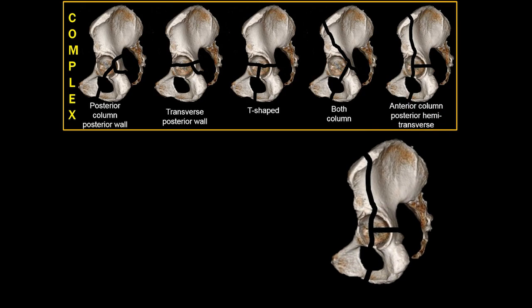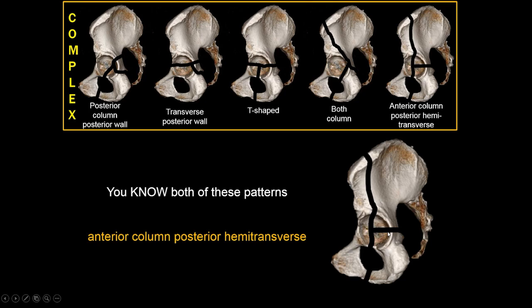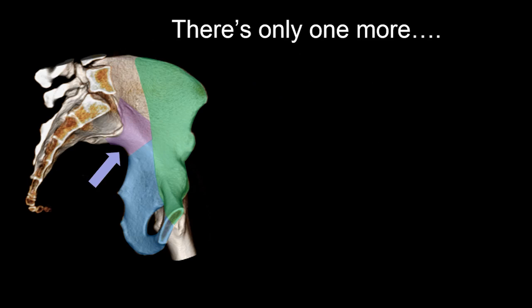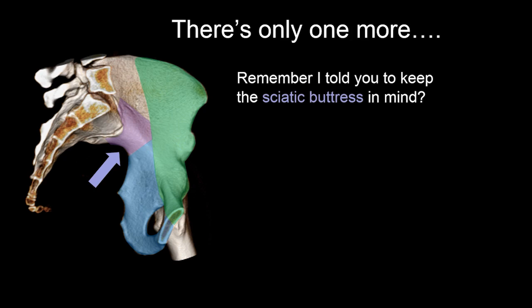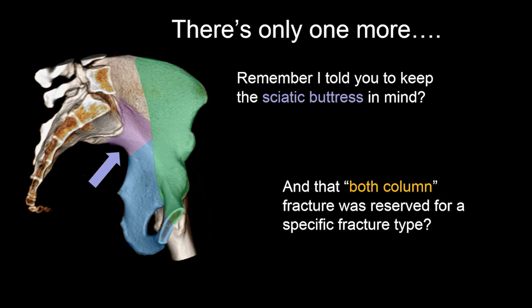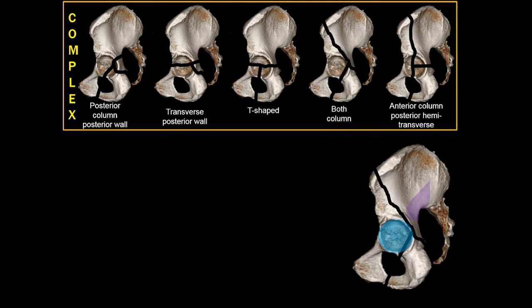The longest-named fracture type is the anterior column posterior hemitransverse. It tends to scare people, but you're already familiar with both patterns: a fracture coming from the iliac wing going down through the acetabulum involving the quadrilateral plate is an anterior column fracture, and you know how to identify the transverse component on coronal images. Put them together and you get an anterior column posterior hemitransverse. And remember to keep the sciatic buttress in mind — the both-column fracture name is reserved for a very specific fracture type under Judet-Letournel.